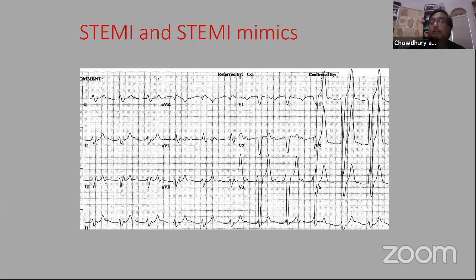Mimics means that it looks like an ST elevation, but it is not MI. In the emergency room, it mimics a STEMI, but the underlying pathophysiology is not STEMI. So like this one, you have ST elevation in this EKG, but there is a peaked tall T wave.